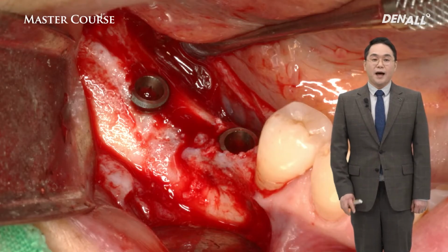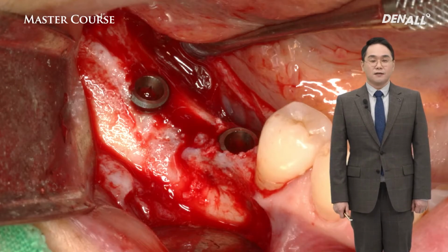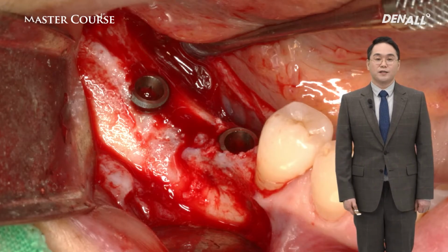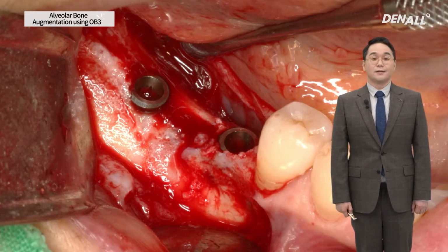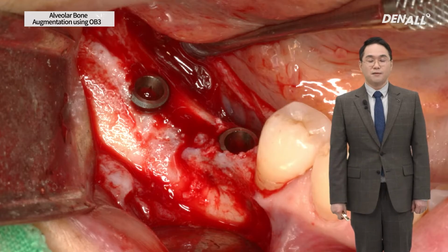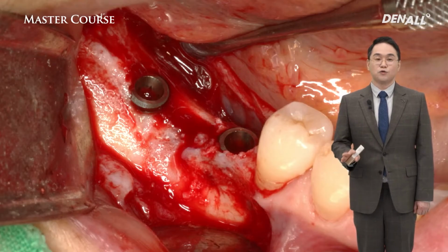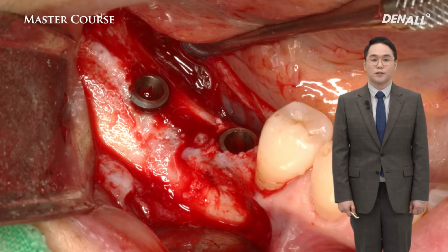The vertical bone defect exists between those 2 implants in the mandible. We can use the standard titanium mesh in the mandible, but we decided to use the Jawbuilder to make it easier. So a tenting screw is placed between implants, and the Jawbuilder will be connected to the tenting screw. So over the implants at number 46 and 47, vertical bone augmentation will be done.